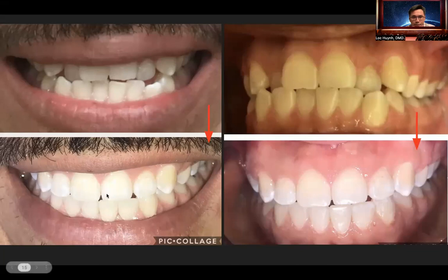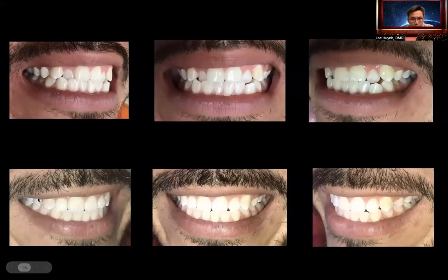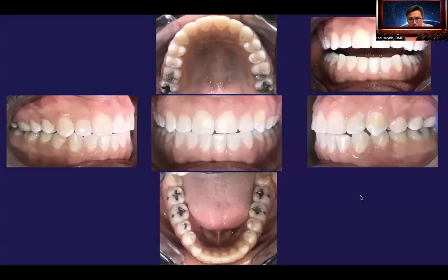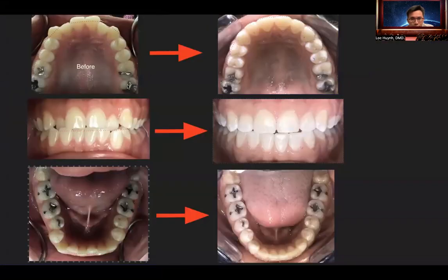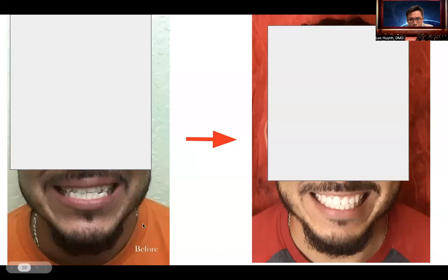Look at the improvement. This is before and after — we corrected the canine eruption here, moved them straight, and the patient was happy. Before and after across all views — from crowded and crooked to straight. The result is amazingly different.